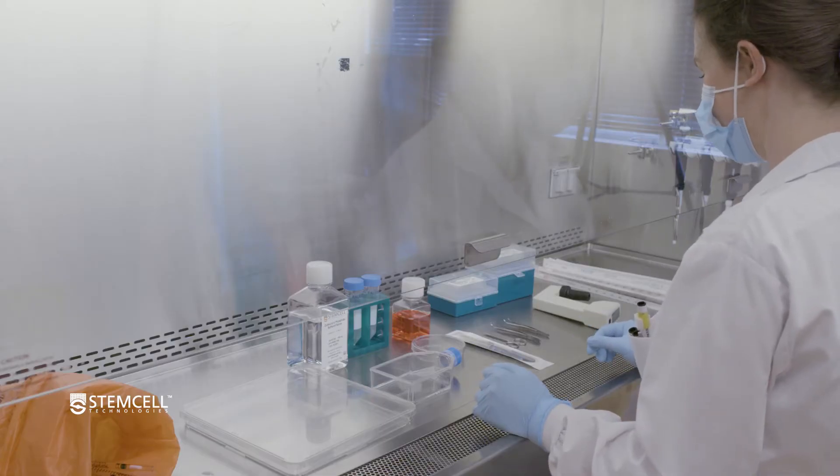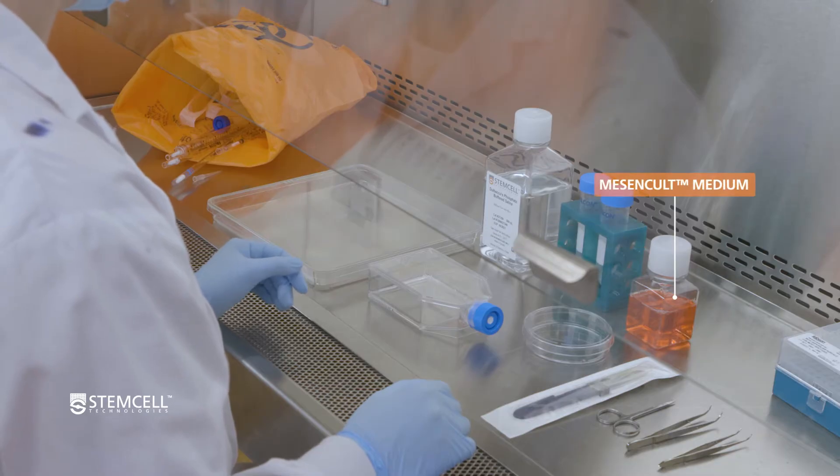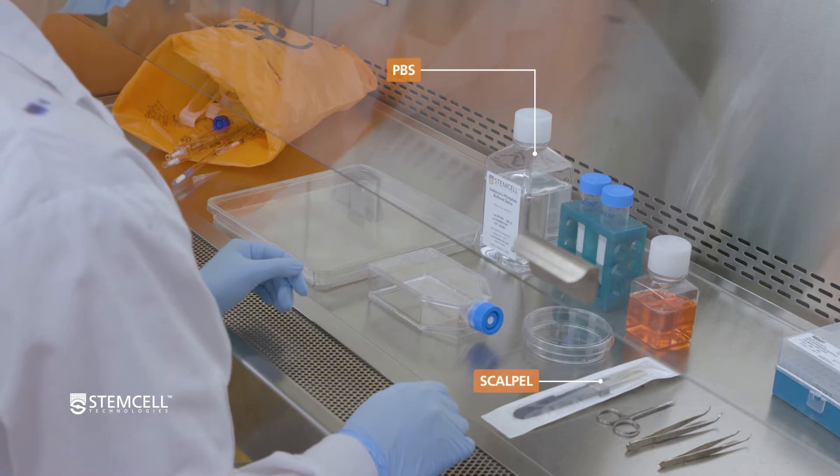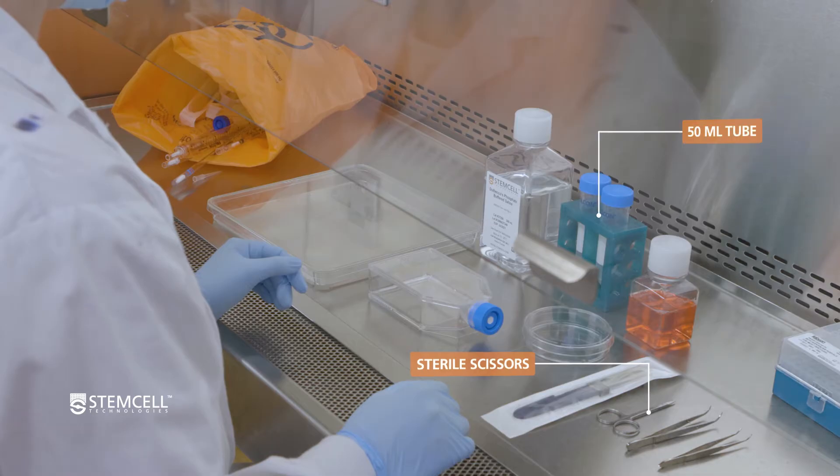Next, prepare the sterile dissection area. You will need culture wear pre-coated with ACF attachment substrate, complete MesenCult ACF Plus Umbilical Cord Medium, PBS, a sterile scalpel, 2 sterile forceps, a 10-centimeter sterile dissecting dish or larger, a tissue chopper or sterile scissors, and 50 ml falcon tubes.